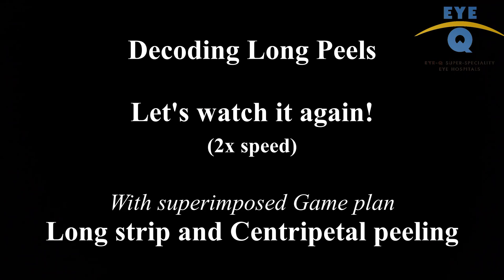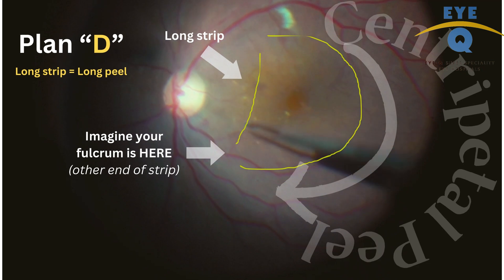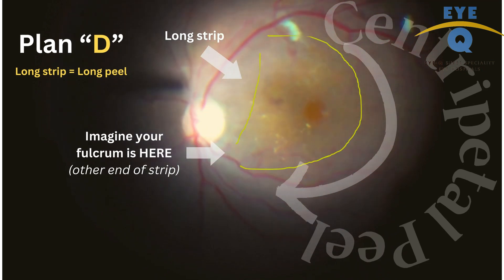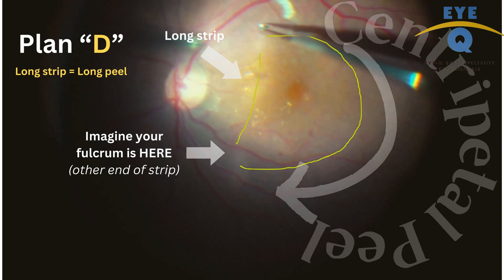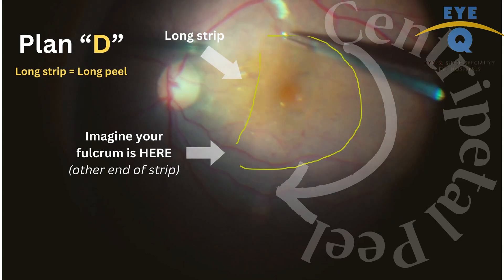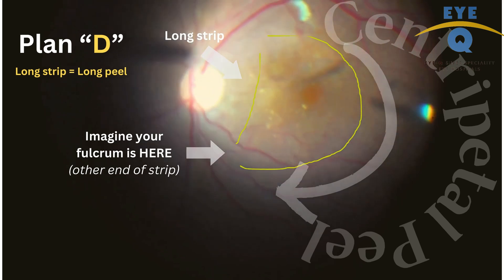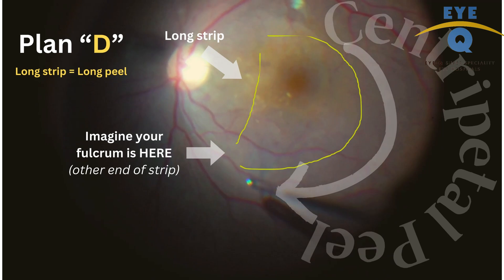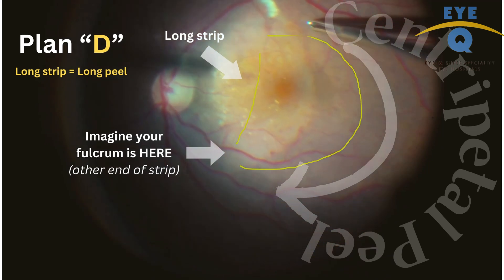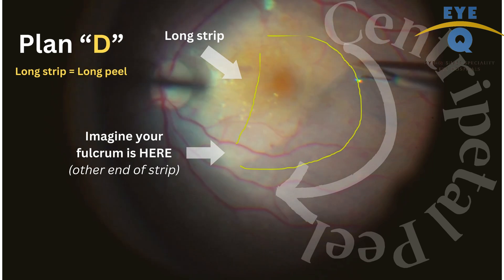Now watch it again with the overlay of the peeling plan. We start with creating a long strip and then initiate circumferential peeling, imagining that the fulcrum of your centripetal movement is the other end of the strip. That is how you achieve a D-shaped peeling, and you can enlarge it with the same technique.